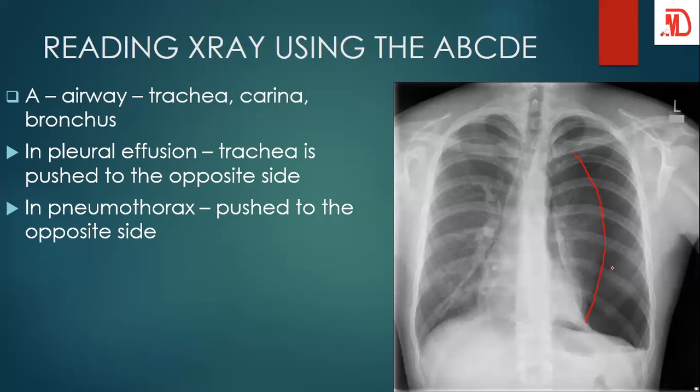And that is where your clinical history is important. So in the history, was there any form of trauma like RTA, road traffic accident, or anything that tells you that I'm suspecting this? That is why I think we will give the best judgment of this X-ray rather than a radiologist, because radiologists don't really know the history, but we have the history. So it's easy for us to diagnose. And maybe to help them, that's why on our X-ray forms, they say brief history. But sometimes we don't even write it. But basically, this is the reason why, so that they know what they should be looking out for.